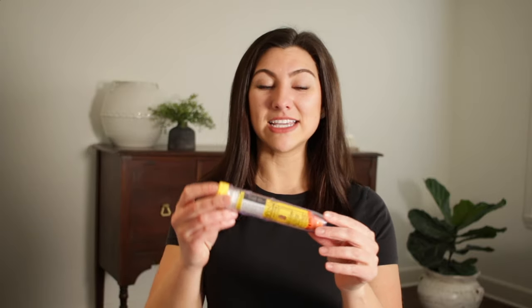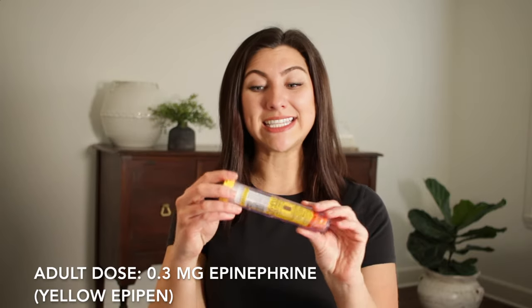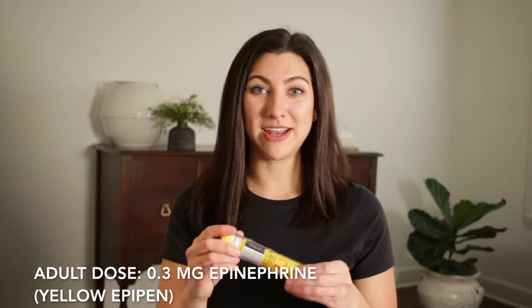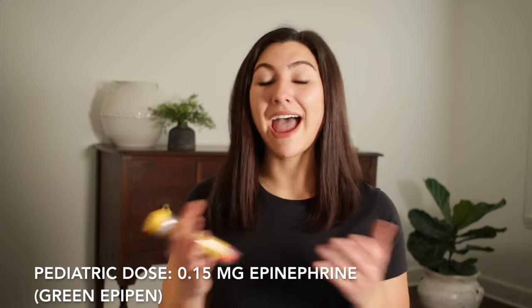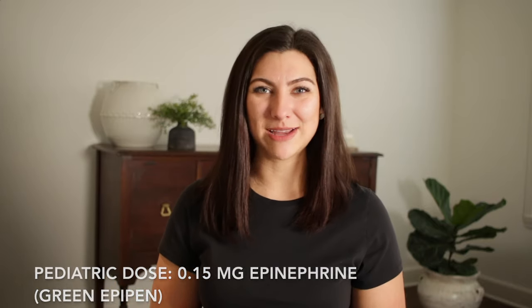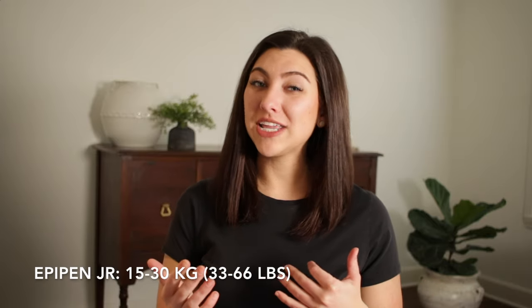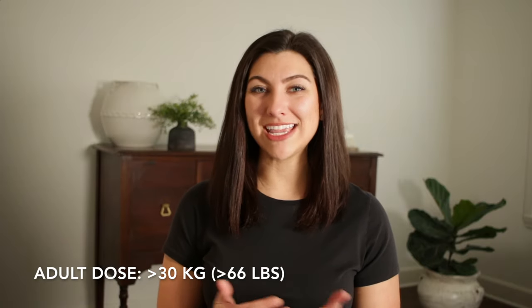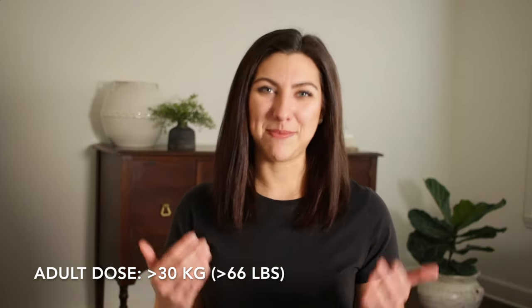Let's talk about the dosing of an EpiPen. An EpiPen comes in a normal adult dose, which is the yellow EpiPen, and this is 0.3 milligrams of epinephrine. There's also a smaller EpiPen that is green — the EpiPen Junior — which has half the dose, or 0.15 milligrams. If your patient is between 15 and 30 kilos, you will use the EpiPen Junior. If your patient is above 30 kilos, you will use the normal adult EpiPen.